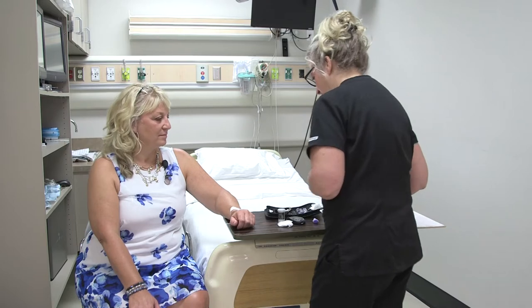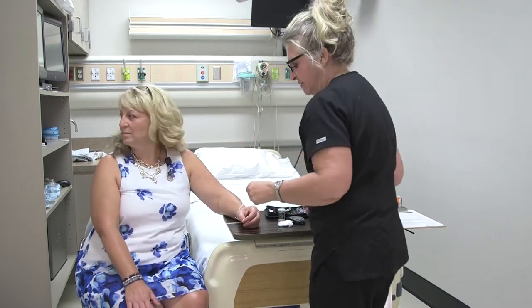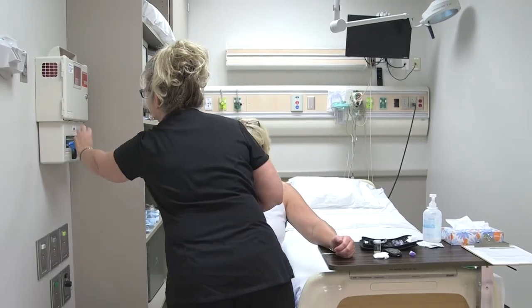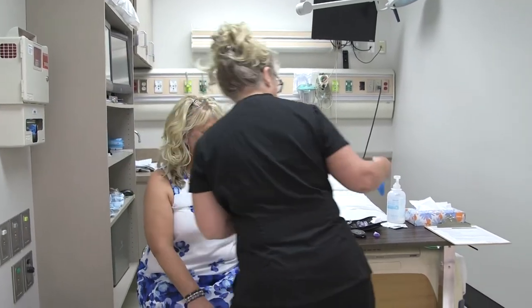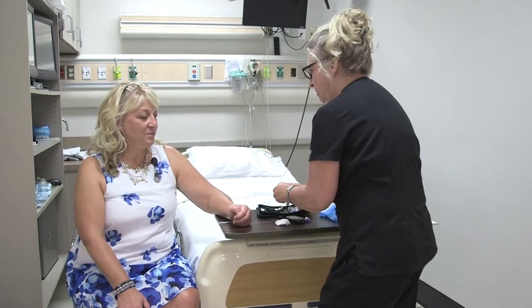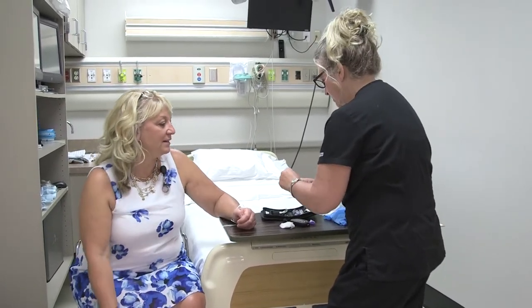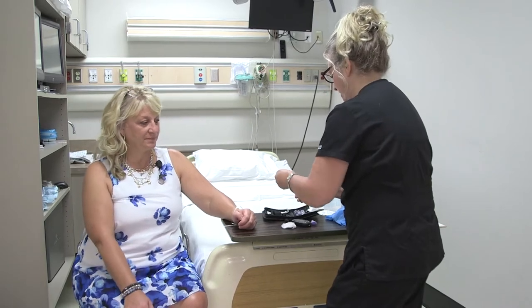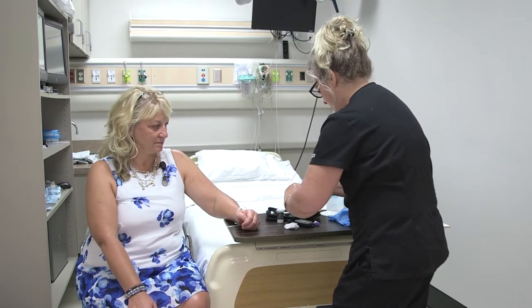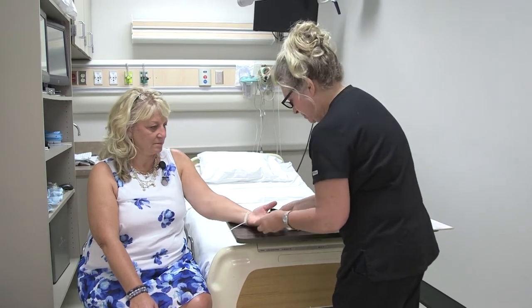I'm going to go ahead and begin — I'm going to grab a pair of gloves. Do you check your blood sugar at home, Sylvia? I do — every morning before I eat and then at night before I go to bed. Okay, very good. That's kind of what we're doing today, the same kind of thing. Let me just make sure I have all my equipment.